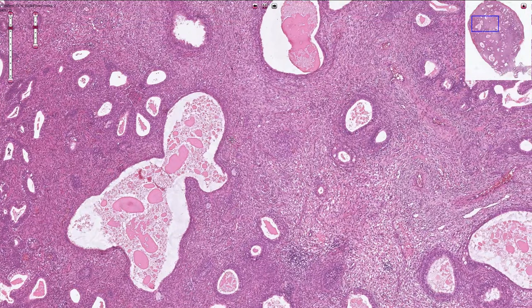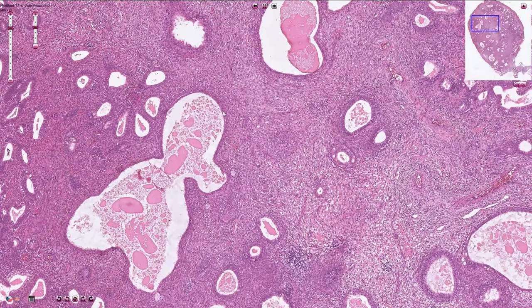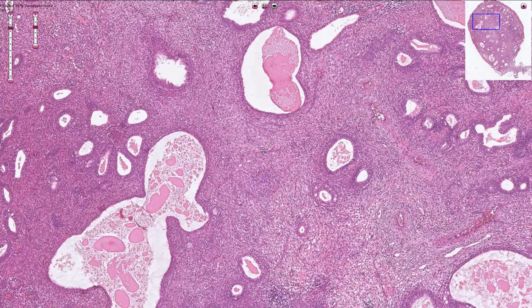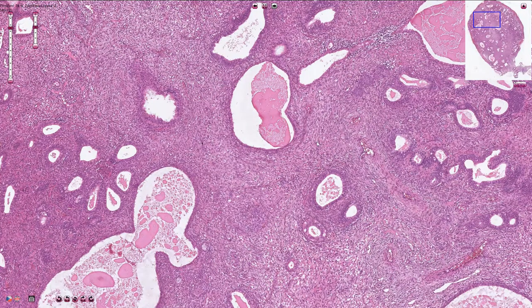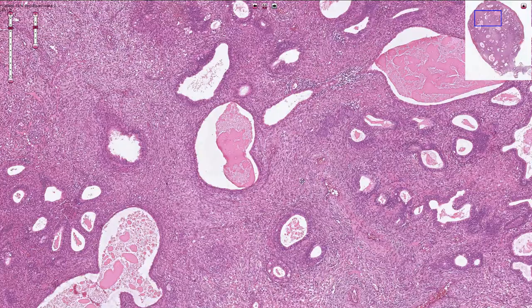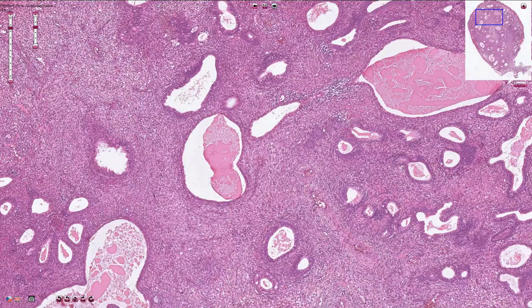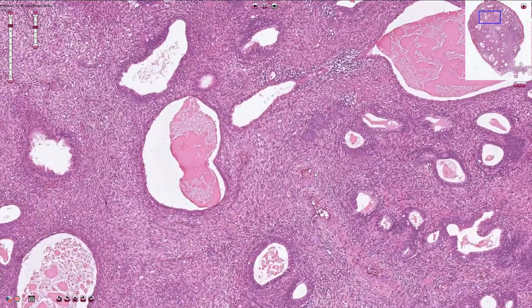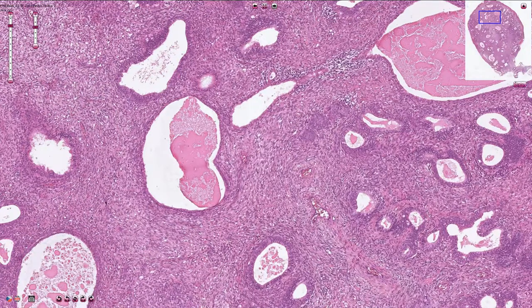No atypical epithelial features should be seen, and we need to exclude endometrial intraepithelial neoplasia or endometrial adenocarcinoma inside of the polyp. Here we have the thick-walled blood vessels in the stroma, which is the third important component of the endometrial polyp.